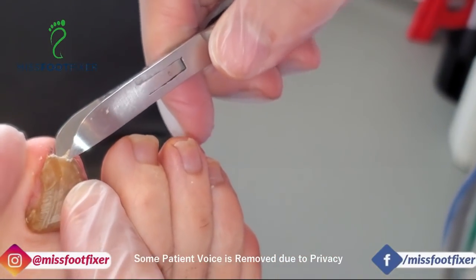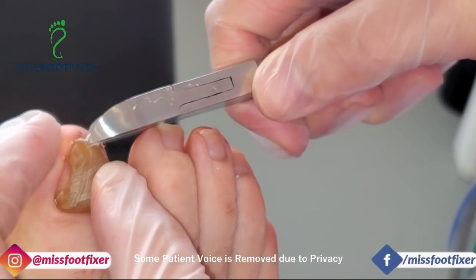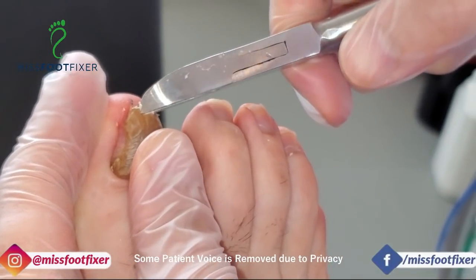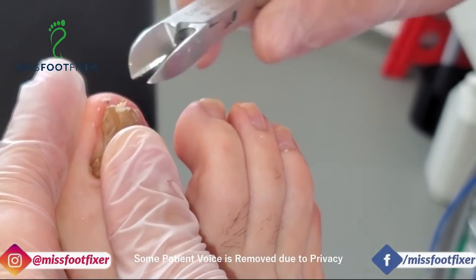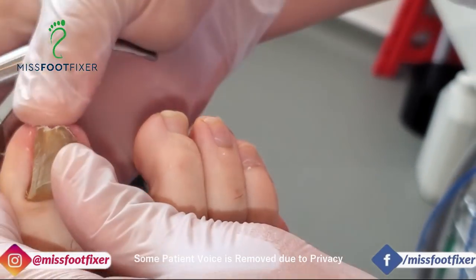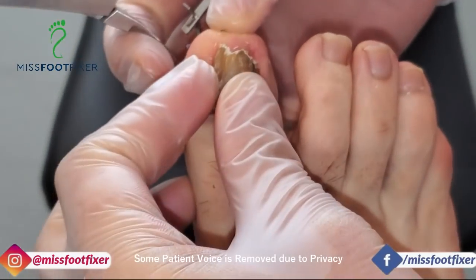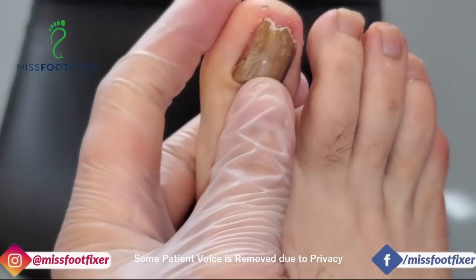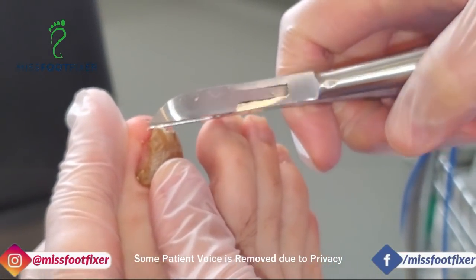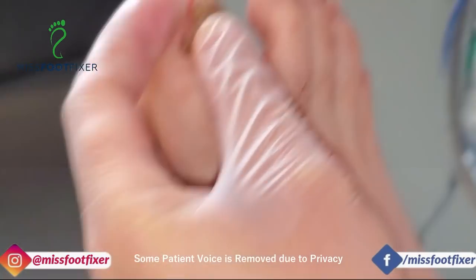I know. No cutting yet. I'm just there. There you go. Little bites, little nips. That is detached, I believe. Yeah, it is detached. I don't wonder why. So it's probably just the pressure from the base. Yeah, exactly. I'm trying to hold.